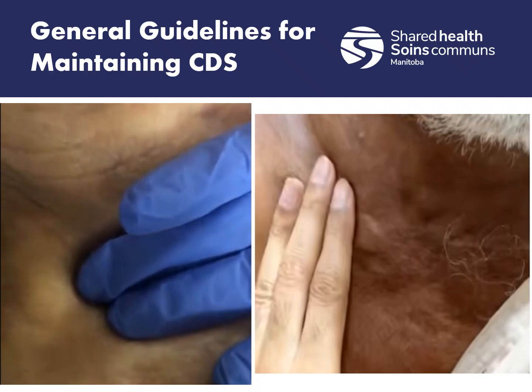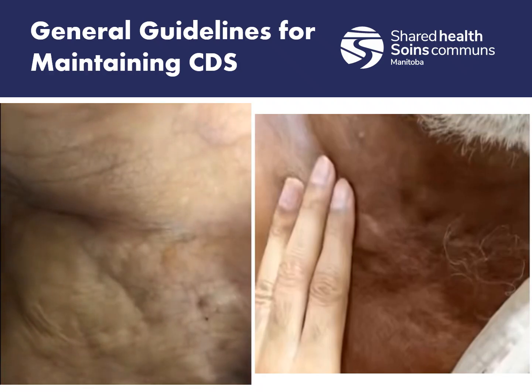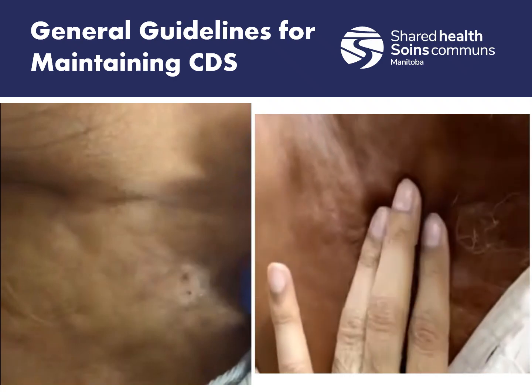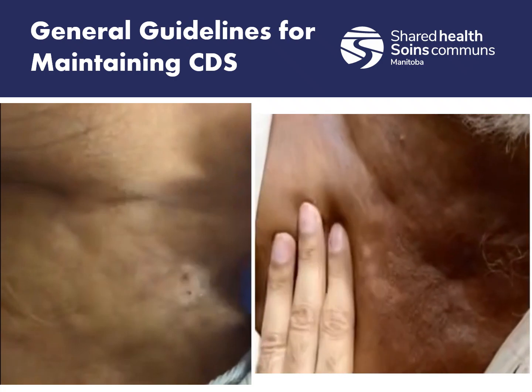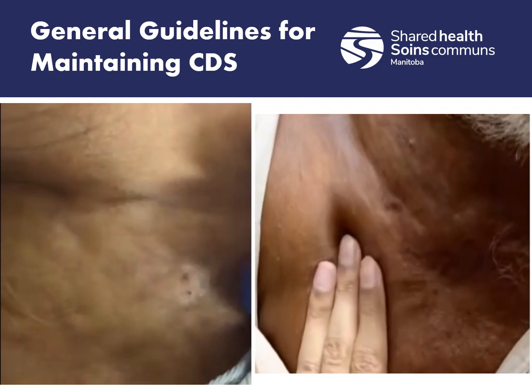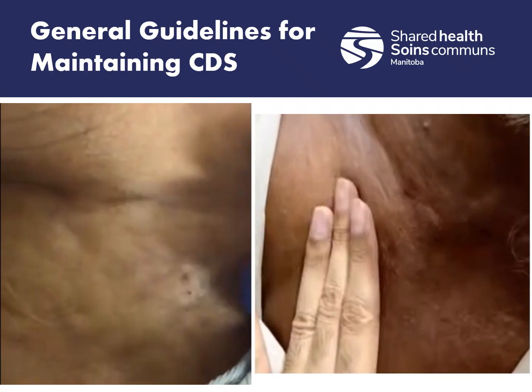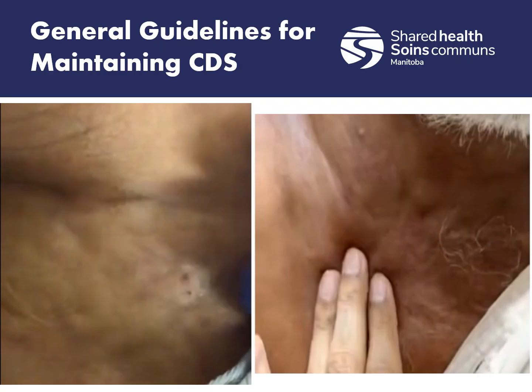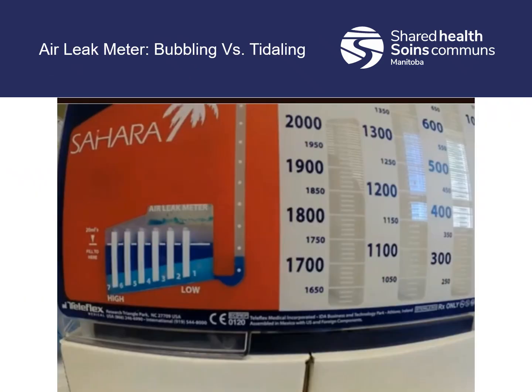And especially around the insertion site, this tells you that the tube might have become dislodged. The other one here is a video of a gentleman who has a giant air pocket underneath the skin, and they're basically just pushing it around. If you see anything like that, I don't recommend you keep pushing it, but it shows us that air is leaking somewhere from the tube underneath the skin, and that is definitely something of note and concern.